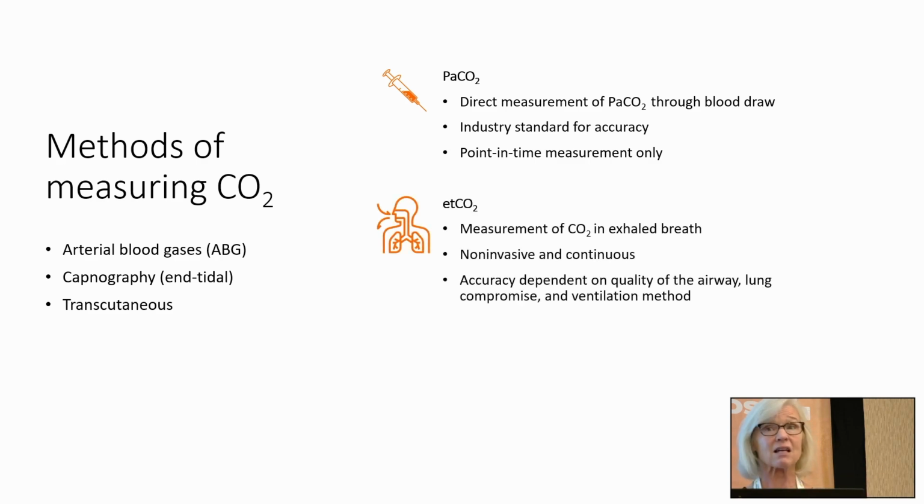We also have end-tidal CO2, which is great. I mean, when you think about it, it's really impressive. The CO2 in your exhaled breath is an accurate representation of your CO2 in your blood. But only as long as you have healthy lungs and you don't have a ventilation perfusion mismatch. And I promise you, you will very clearly understand that whole mechanism here in a minute.